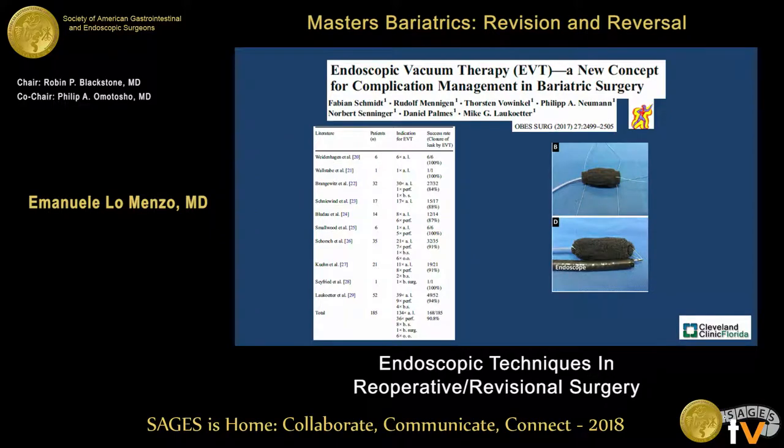The new concept is endoluminal vacuum therapy — not actually a new idea, as it stems from the use of wound vac dressings for abdominal and external wounds. This is customized and applied to the end of an NG tube after the leak has been sized. The sponge is sutured to the NG tube with a loop placed at the end so we can drag it by the endoscope directly to the site of the leak. It requires frequent change — usually every four or five days — because we don't want too much granulation to grow into the sponge.